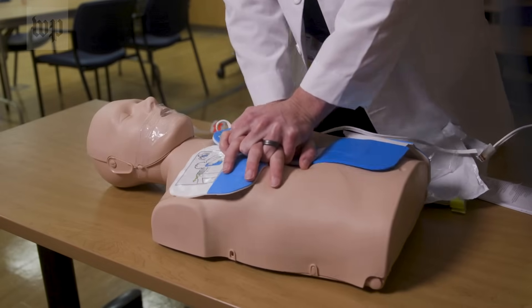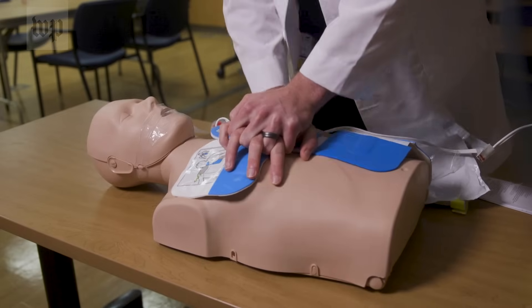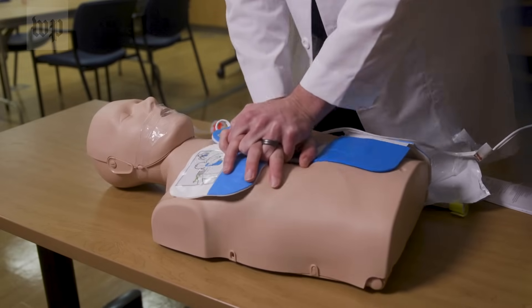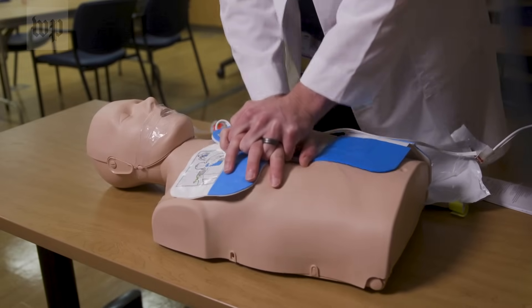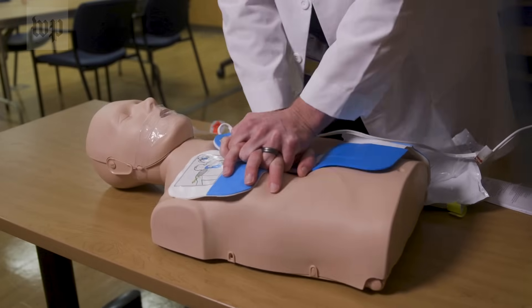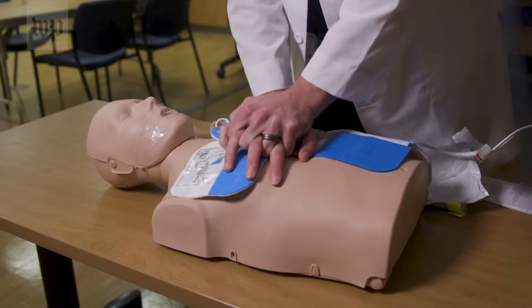The device may prompt 'Push harder' to guide your compressions, and then confirm 'Good compressions.' This AED gives you feedback on your compressions to make sure you're doing them at a correct rate and a correct depth, which can be very helpful.